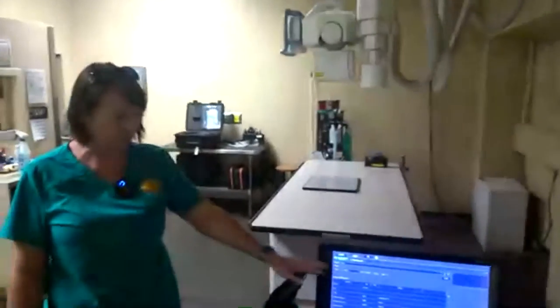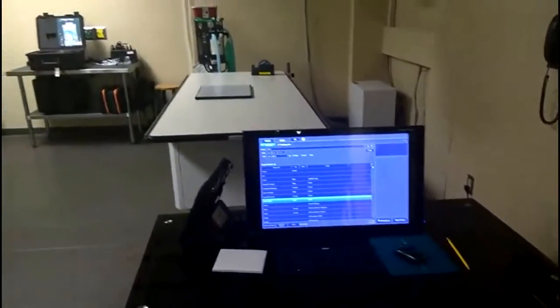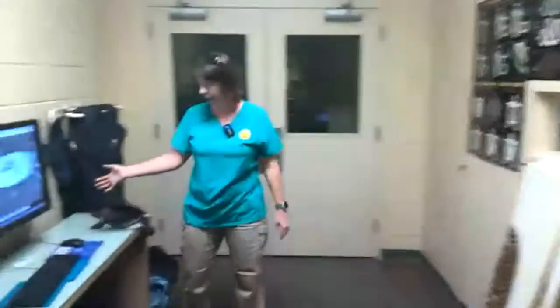This is our radiology. We do x-rays in here. If you're wondering what radiology is, we can put in the animal's information. We take their picture on there and then it pops up over here. So I have an image to show you guys.